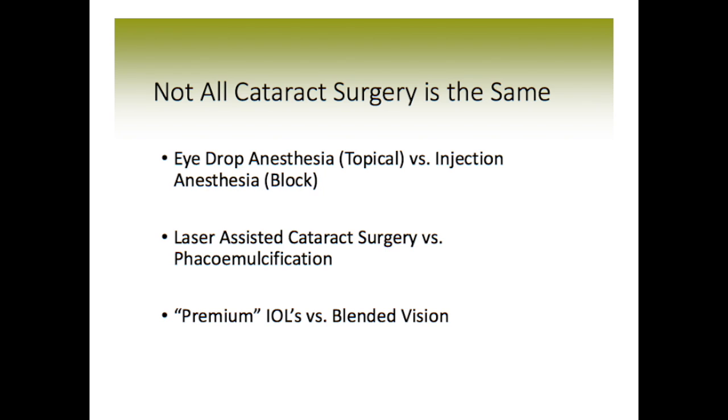There's eye drop anesthesia, known as topical anesthesia, versus a needle injection, known as a block anesthetic. There's laser-assisted cataract surgery, which is relatively new, and is combined with phacoemulsification, versus traditional phacoemulsification. And then there are techniques to try to minimize your need for glasses after cataract surgery, so-called premium intraocular lenses versus blended vision.